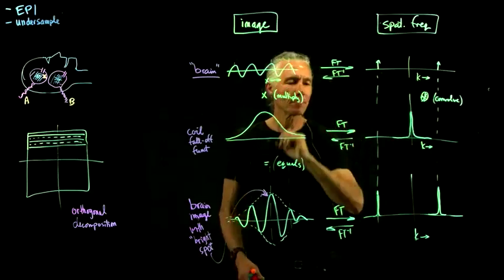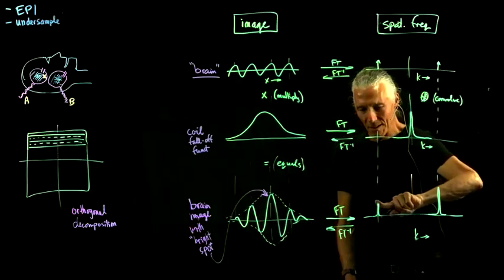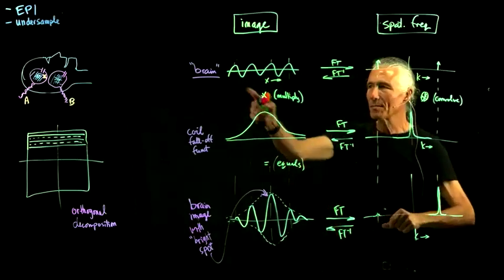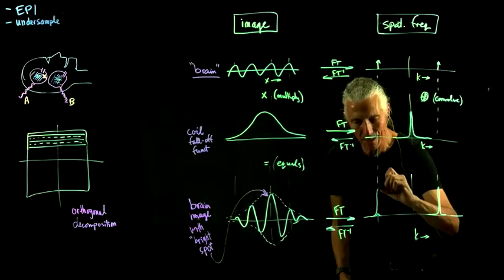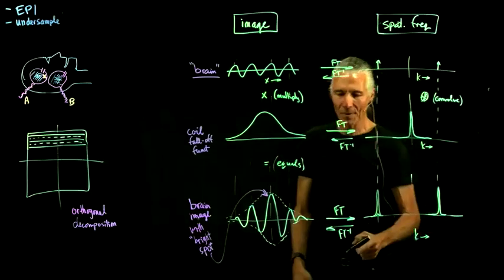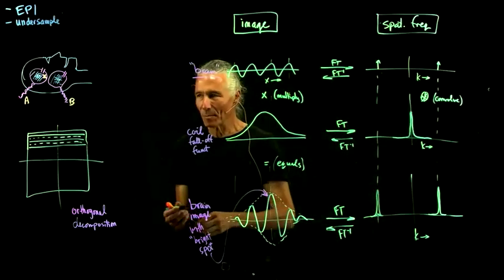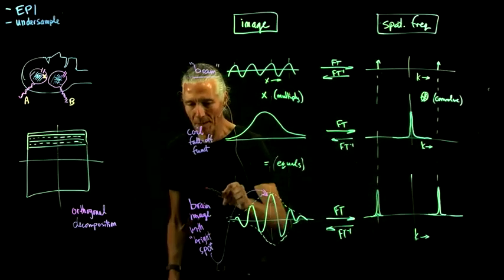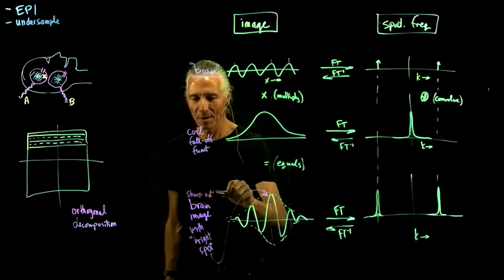We've blurred the spatial frequencies of this original signal, which just used to have two little spikes in it. We haven't blurred the image. All it does is make an image with a bright spot. It makes a sharp, not blurred, brain image.